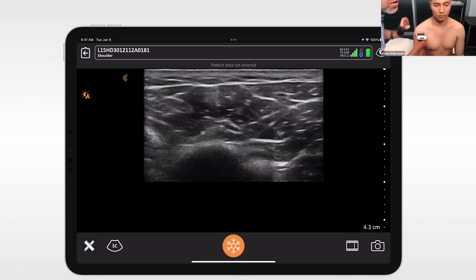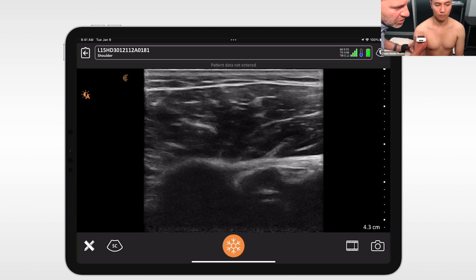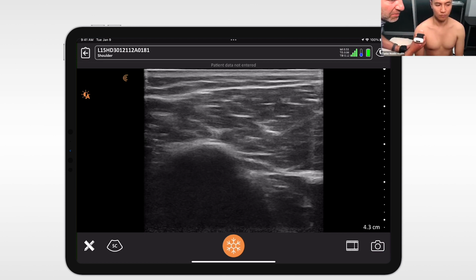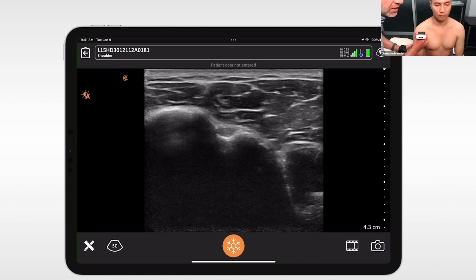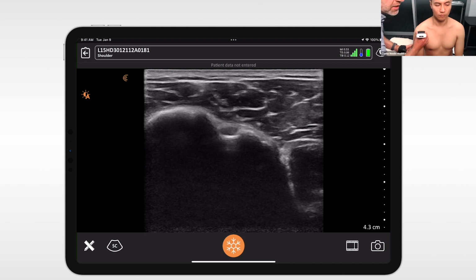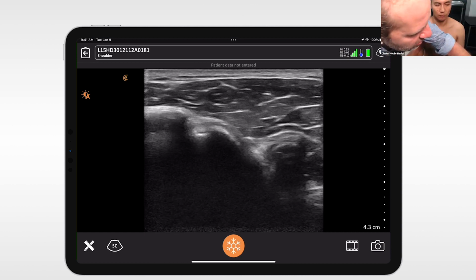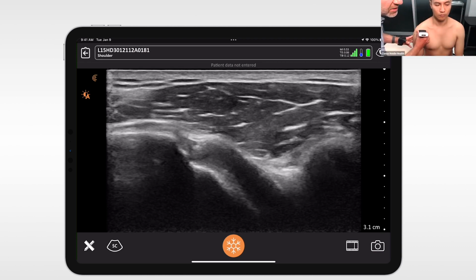And you scanned, let's get some depth here, down into the bicep belly, which I don't routinely do if patients don't have a lot of pain. Maybe that's because I'm seeing them only in the acute setting. But I do love how you go up proximal into the rotator interval, which we did a whole webinar on before. So yes, if you want to know more. So that's the interval here, right?